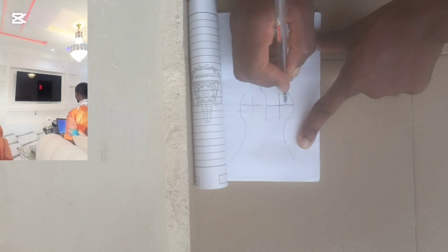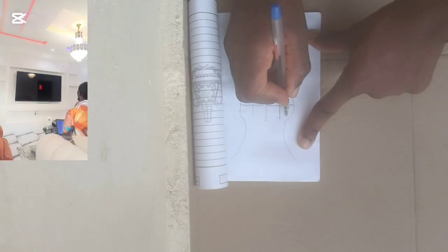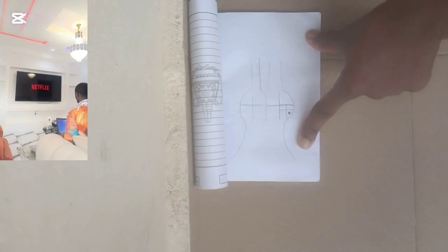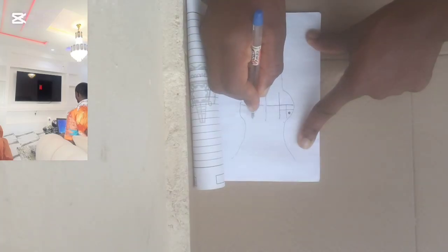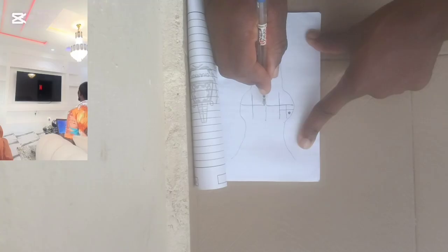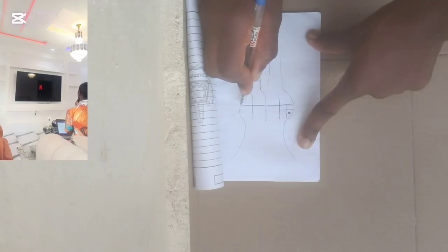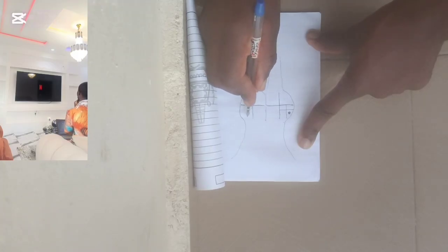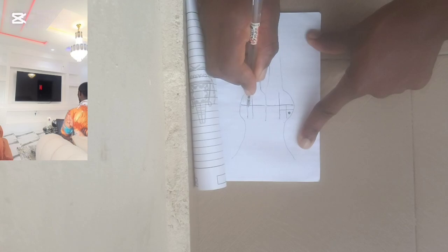After making the first cross sign on the buttock, you are meant to make another quick cross sign. The reason why is because you really need to be away from the sciatic nerve. After which you make a dotted sign on the buttock, which means that is the spot where you are going to administer that medication.